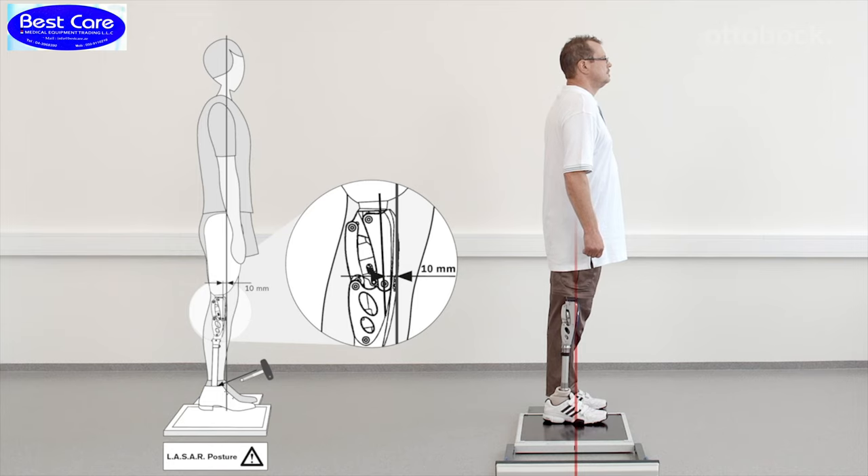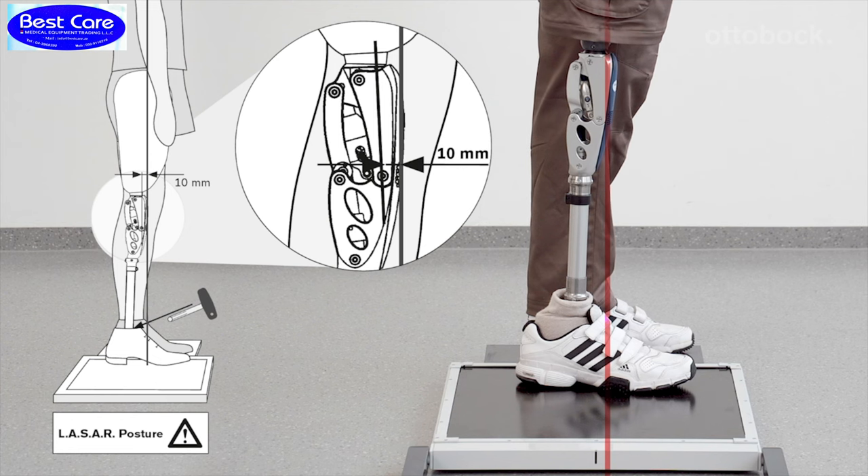The sagittal plane alignment should now be adjusted solely by changing plantar flexion so that the load line runs about 10 millimeters in front of the anterior lower knee axis.